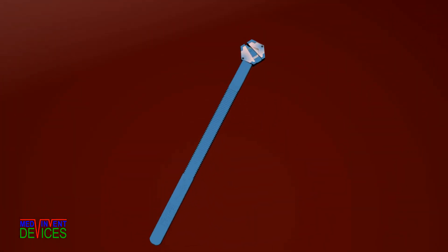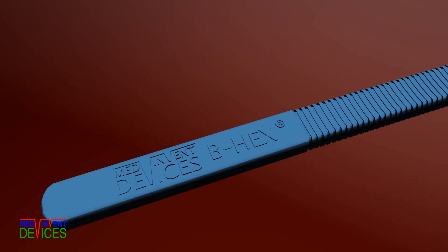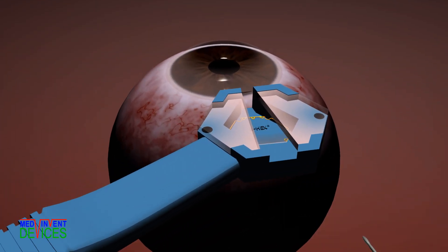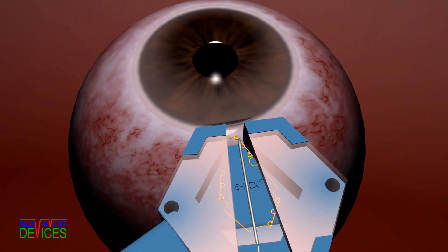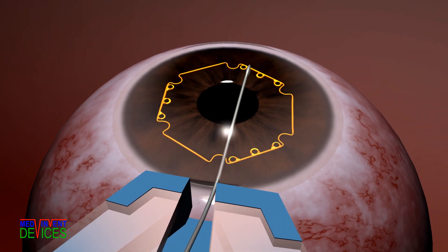The ergonomically designed housing presents the preloaded sterile device at the incision. After viscoelastic is placed into the housing, the B-Hex 23 gauge forceps advances the device through the incision into the eye to simply place it on the iris without tucking any of the flanges.